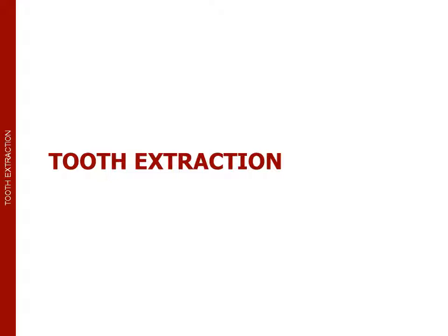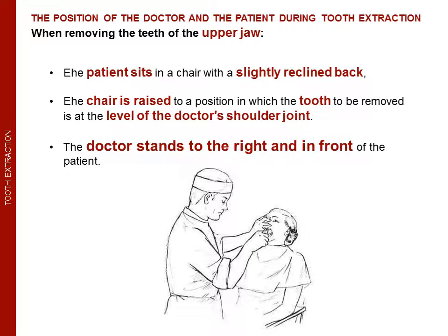Tooth extraction. The position of the doctor and the patient during tooth extraction.